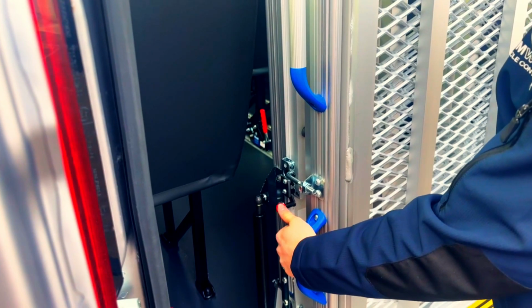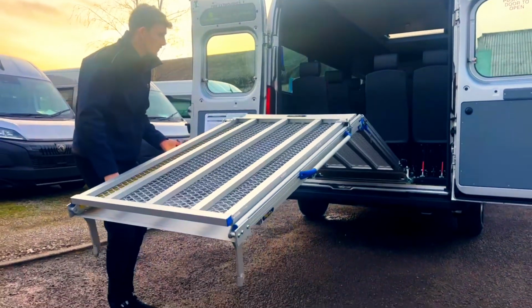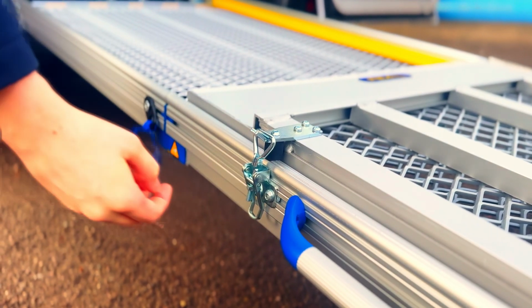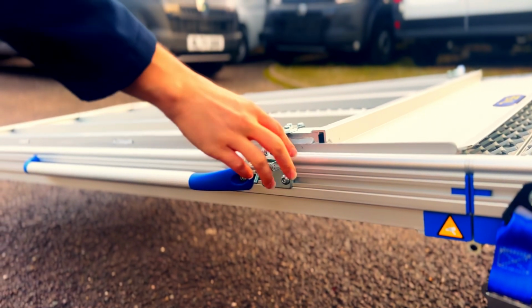Step 2. Locate the red pin catch and release the ramp. Once released, carefully begin unfolding the ramp outwards. Step 3. Next, unbuckle the clips that keep the final section secured. This allows for a smooth and complete extension.